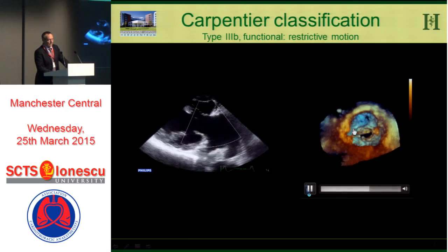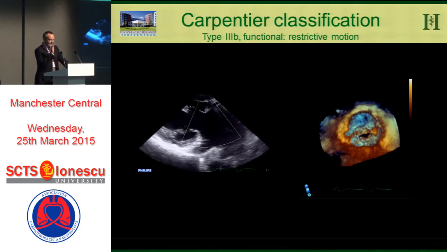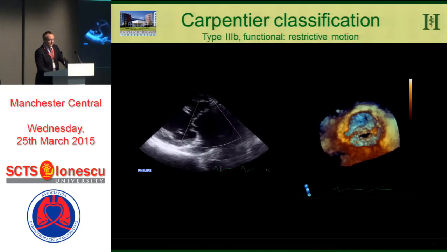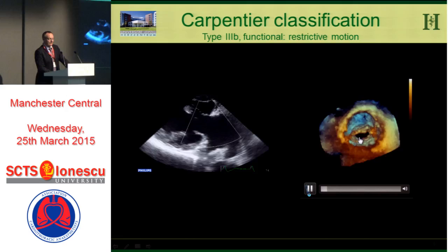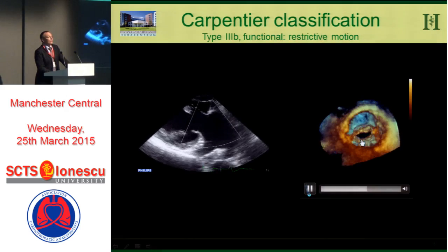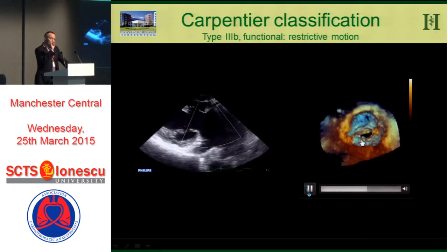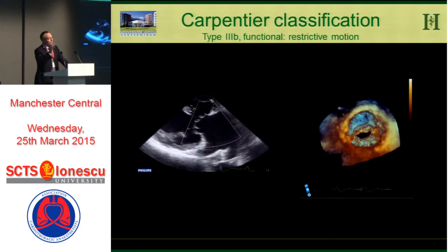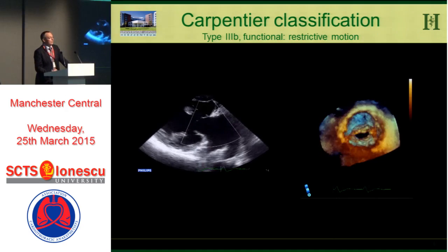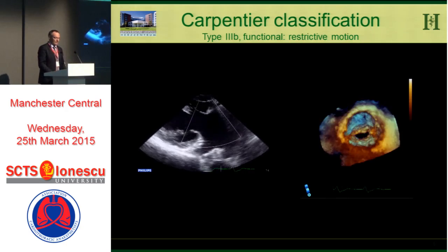In the transgastric view, you can see that the posterior mitral leaflet is really tethered into the left ventricle due to the dilated left ventricle. In the 3D view, looking from the left ventricle upward from the apex toward the mitral valve — which is the vice versa perspective from the left atrial view — this is the P3 region, where the most pronounced restriction occurs in type 3B, because it is mostly the posterior part of the ventricle that tethers the posterior leaflet.